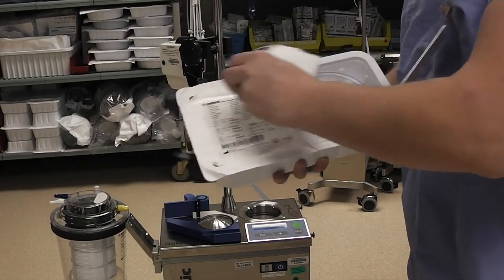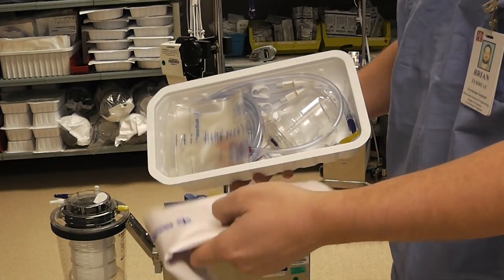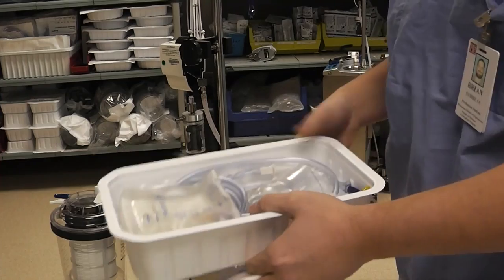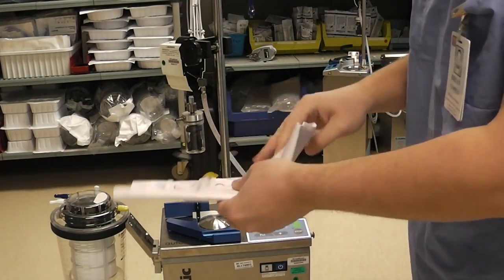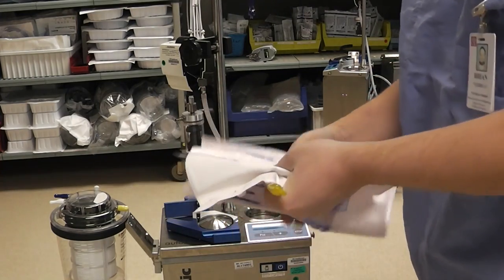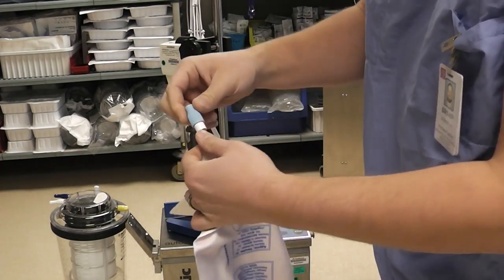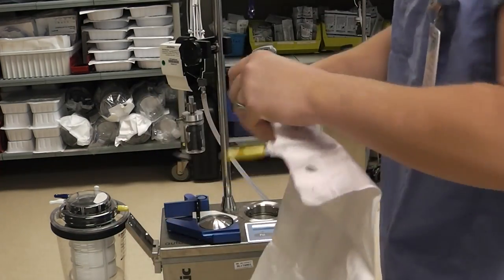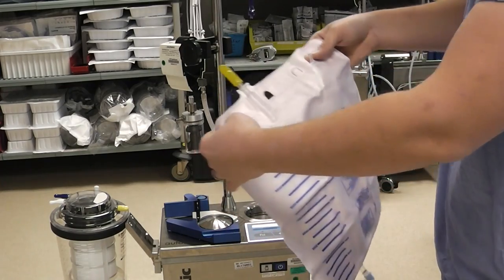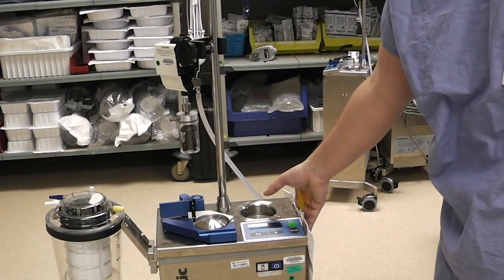Next we will open up the wash kit and we will save this label for later use. We will then take out the waste bag, set the rest aside, and we will hang the waste bag on the right hand side of the machine. Before we do that we want to make sure that this valve at the bottom of the bag is completely closed, otherwise we could get waste all over the floor. So open up these tabs and hang it on the hangers on the side of the cell saver.